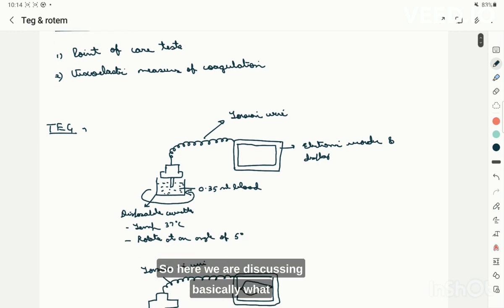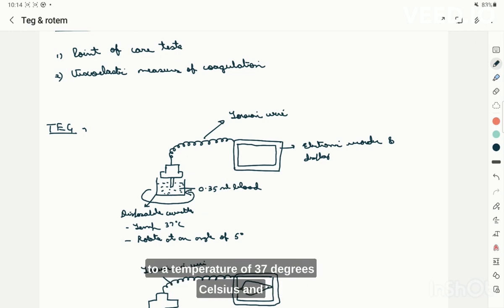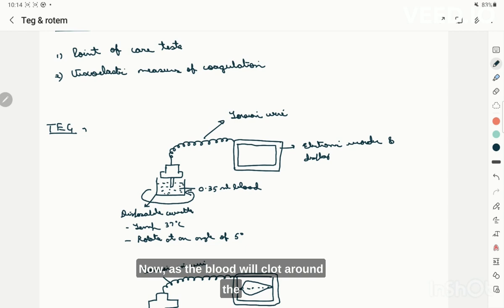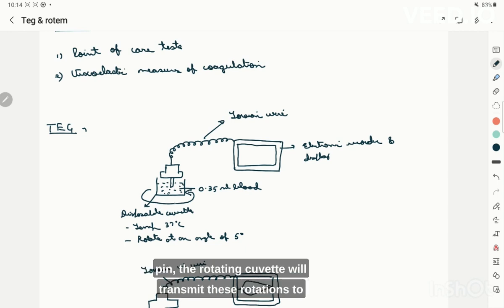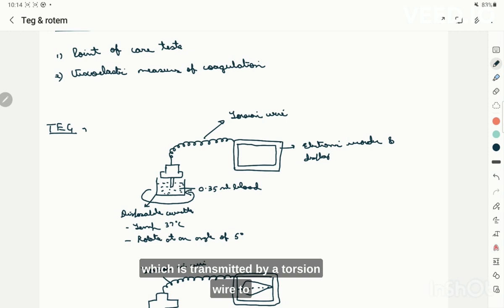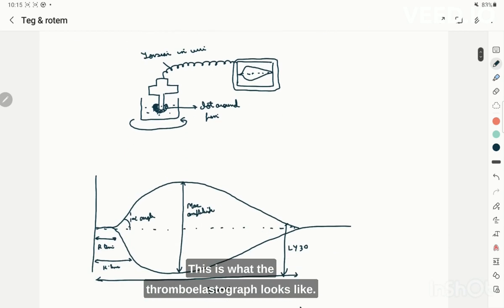The thromboelastography machine has a disposable cuvette which is heated to 37 degrees Celsius and rotates at an angle of 5 degrees. We put 0.35 ml of blood in this cuvette and then a pin is inserted into the blood. As the blood clots around the pin, the rotating cuvette transmits these rotations to the pin, producing torsion which is carried by a torsion wire to an electronic recorder and display.